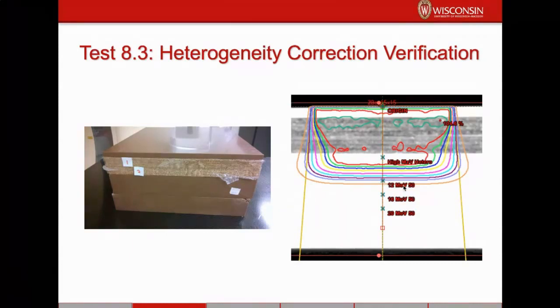And then we used solid water to actually measure where that was located. We found that in the case of Eclipse, the calculations and measurements were within about a millimeter of one another. So that showed that not only is Eclipse getting the absolute dose at Dmax correct, it's also modeling the distal falloff really well. So we think that's a valuable variation on this test that's worth considering.